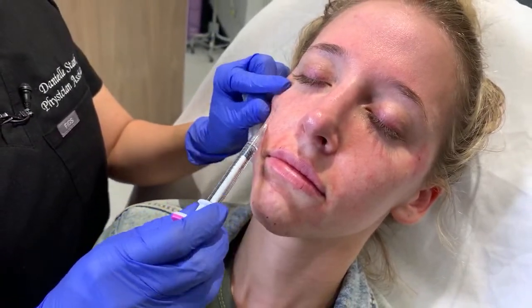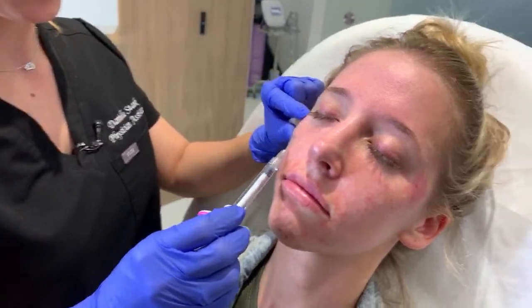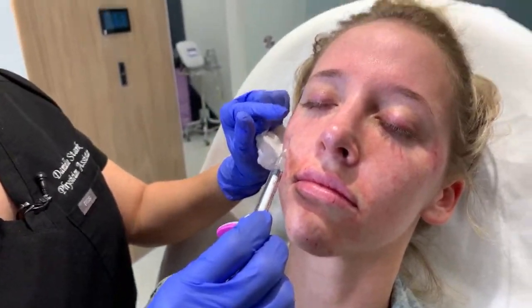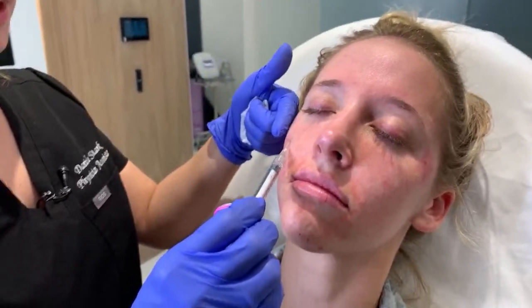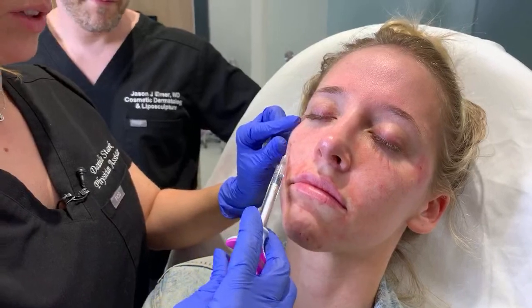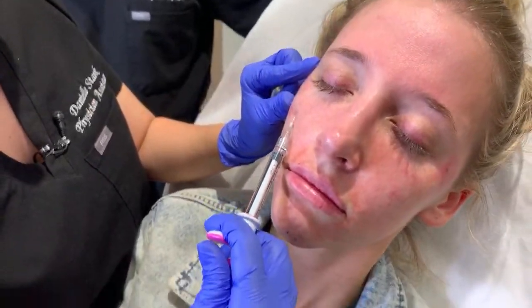Okay, so a lot of people inject under the eyes and they forget this lateral ridge. Also, for patients who like to have their cheeks done, you need to blend this, make it a smooth transition from an elevated cheekbone to the actual ridge of the orbit. So a lot of people neglect it. It's a pretty telltale sign. It bugs us. That was me, for sure.